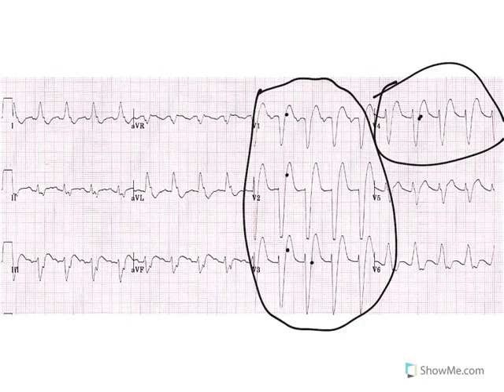But if you're looking at it, you think, geez, that T wave goes way up. And maybe it's a De Winter's. No, it's not a De Winter's. Relax. It's just a left bundle branch block.